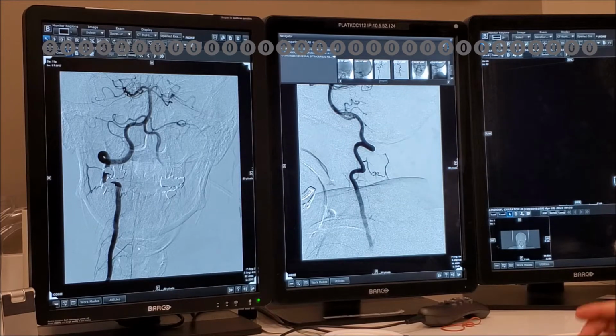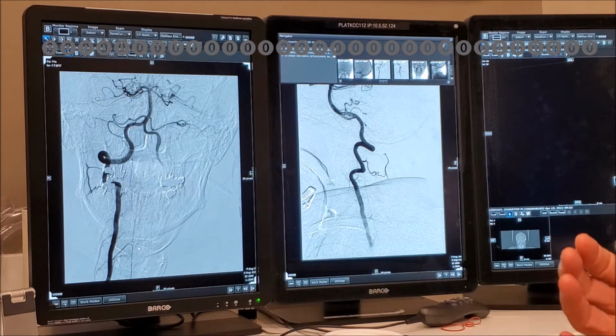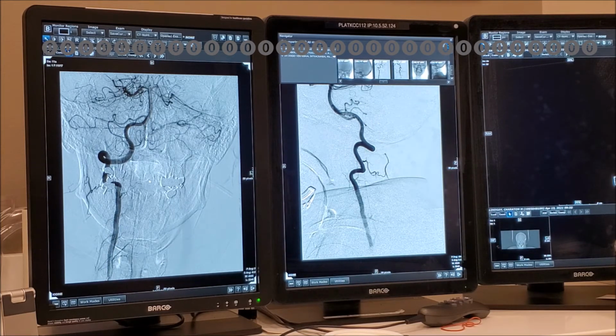Why? Because the spinal cord embryologically is open, and then it fuses, and then it creates only one anterior spinal artery. That's why so frequently you may have duplication of the anterior spinal artery, because incomplete fusion occurred. Okay, now this is quite prominent. We don't see anything from above. Oh, I see something here. This is the lateral, posterolateral.